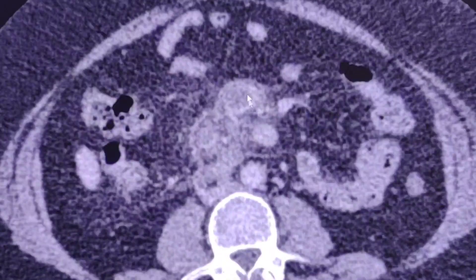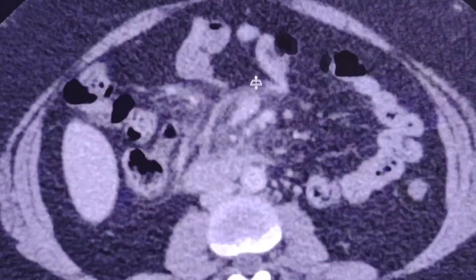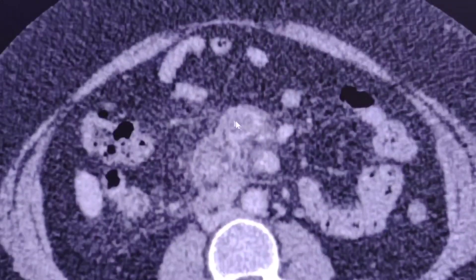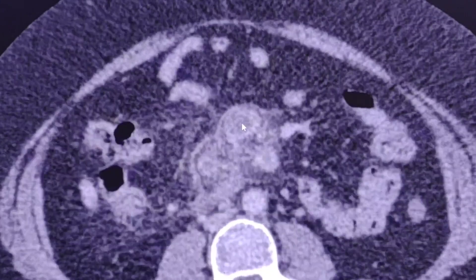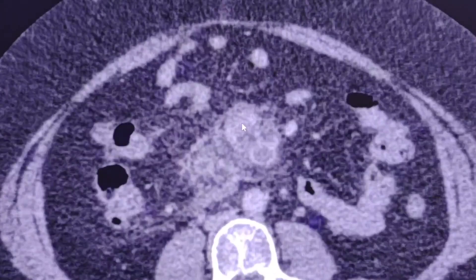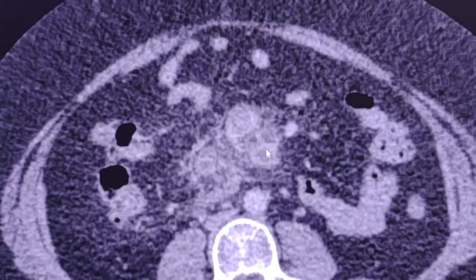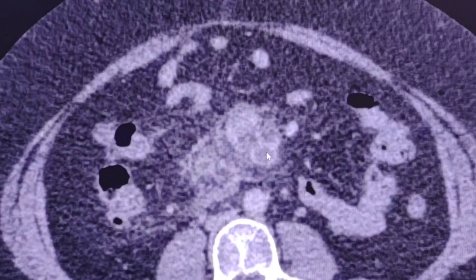Another lymph node is this one. There is possible central necrosis. This is another enlarged lymph node.